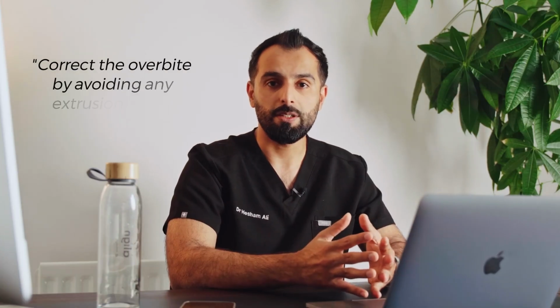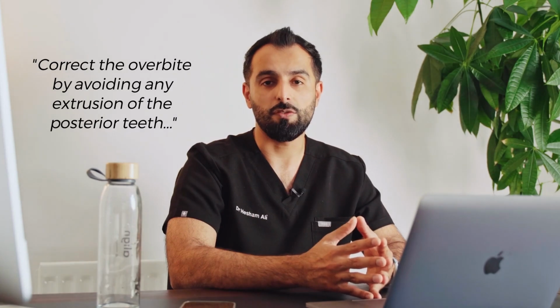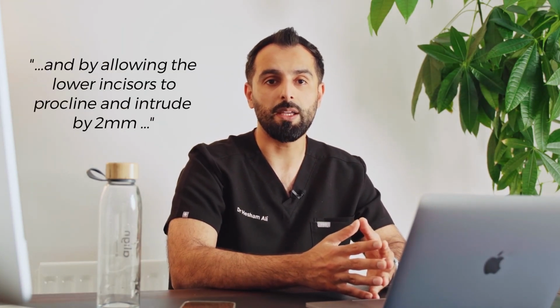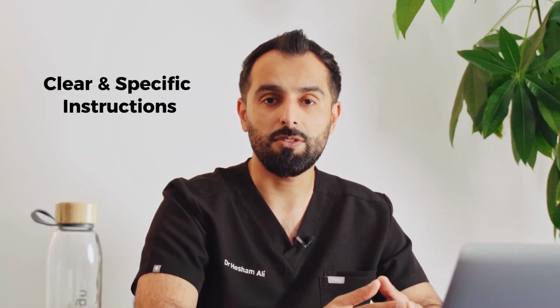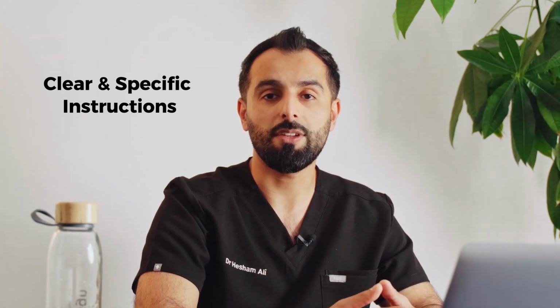Try to explicate this to your technician by writing a sentence about overbite correction. Something, for example, along the lines of correct the overbite by avoiding any extrusion of the posterior teeth and by allowing the lower incisors to procline and intrude by 2 millimeters, or whatever the measurement happens to be in your case. By giving really clear and specific instructions, the technician will know exactly what you're trying to achieve. Now, they're not always going to come back with the perfect plan, but it's going to be closer to what you're asking for by giving as much detailed information as possible.